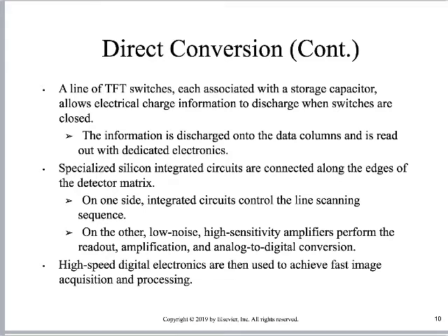All right. So we need a way to control that, as you can imagine. We don't need to just be discharging capacitors left and right. That would not be helpful to anyone, right? So we're going to use integrated circuits to control that. Integrated circuits, what are those? They're just computer parts. They're highly, finely tuned computer parts. And so they consist of essentially ones and zeros, and they determine, should you discharge this capacitor, yes or no, on or off. So we just go through the switches and we determine where the capacitor is discharged.